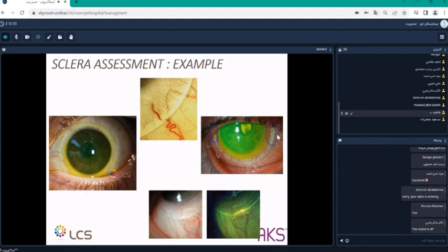When you have such compression, you begin to have a global red eye. So it's normally easy to solve that. I will show you later how to do that, but it's important to assess that and to solve that with a new lens, with the right parameters, in order to avoid any disorders.